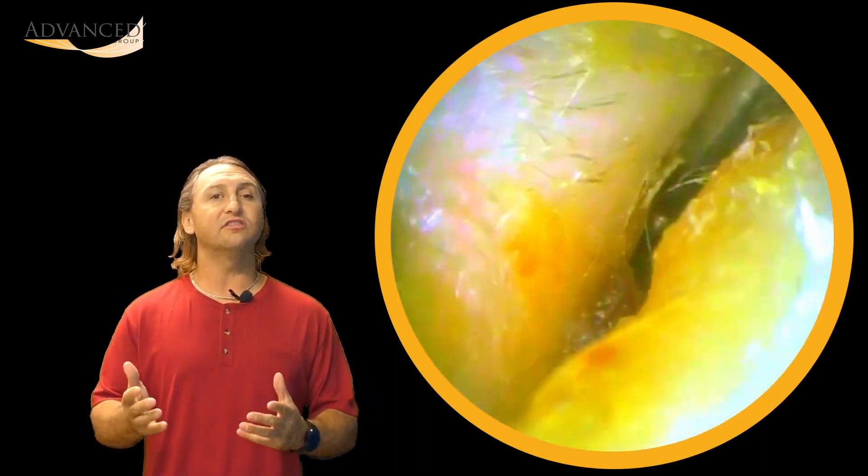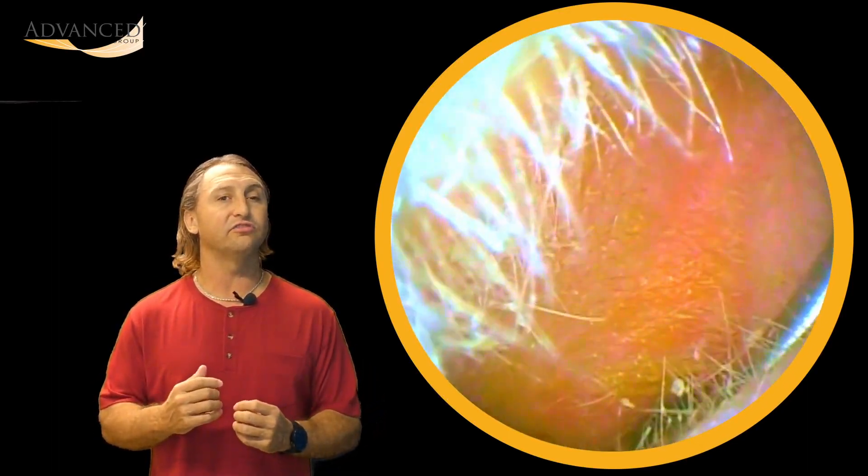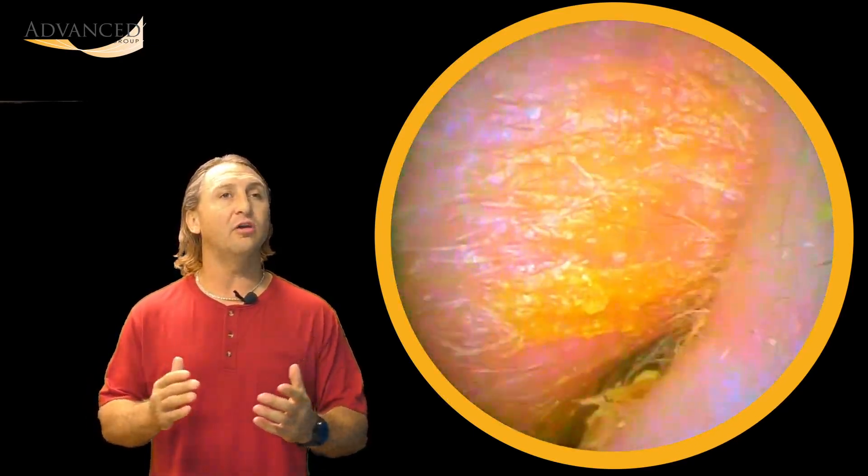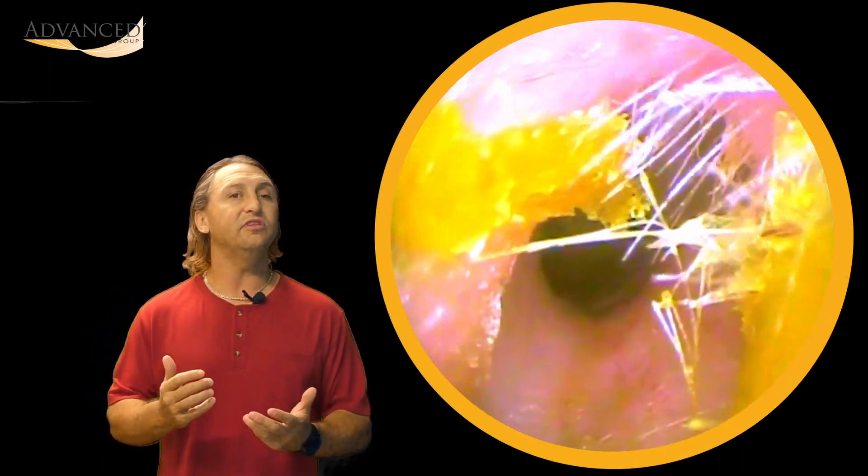Let's start off by looking at this first ear. You can see as the curette goes in, it has to be turned sideways to get past the narrowing of the ear canals. And as we press on the ear canal wall, it opens up, or as I pull on the pinna or the outer ear, it completely opens up.